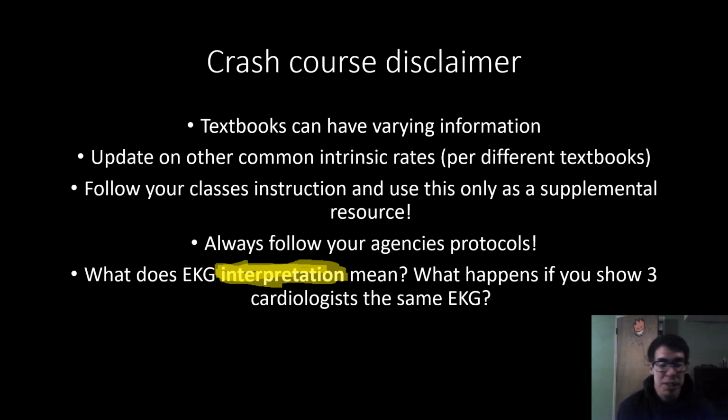Because it's interpretation, some people will say it's this rhythm, some might say it's that rhythm. Sometimes it's more obvious and everyone should know what it is, but there can be times that it's weird, and in that case it's really just your interpretation and whatever rhythm everyone agrees on. So just know that it is a good science, pretty much a perfect science for how it works and records, but as far as determining what the rhythm is, that part could be a little bit of a gray area, I guess.